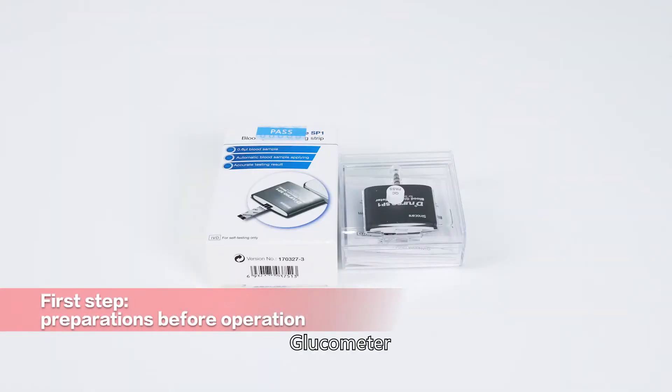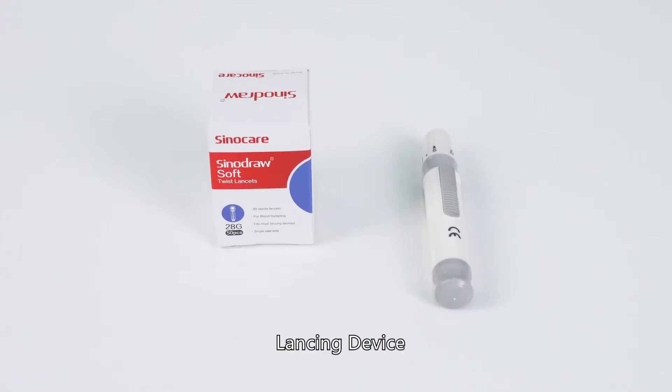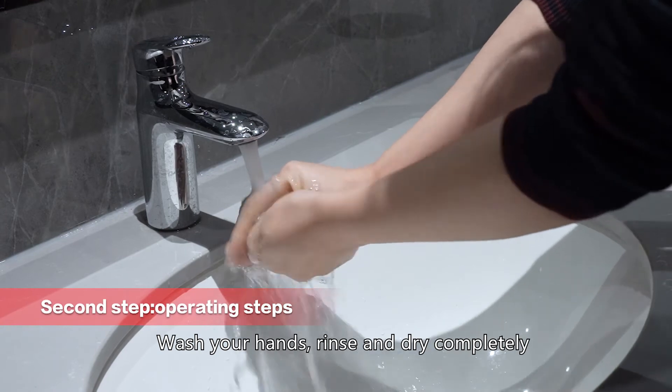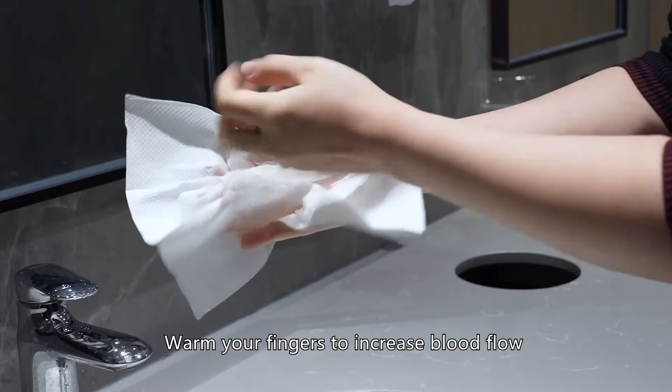Equipment needed: Glucometer, Smart Device, Strip Vial, Lancing Device, and Lancet. Wash your hands, rinse and dry completely. Warm your fingers to increase blood flow.